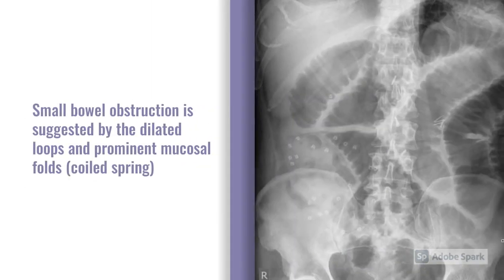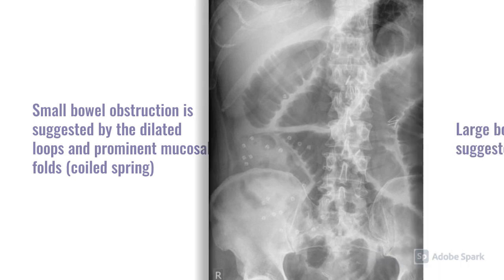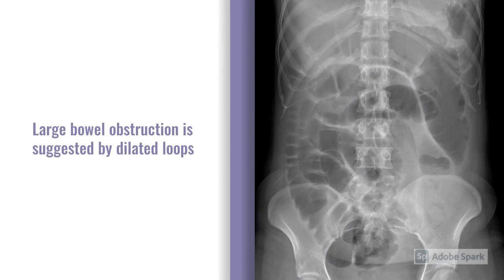The image shows an example of a small bowel obstruction, suggested by the dilated loops and the prominent mucosal folds, often described as a coiled spring type appearance. Even though those loops are dilated, they're not as wide as the large bowel loops — that's how we can say it's a small bowel obstruction. In the next example, we see a large bowel obstruction, again suggested by dilated loops — and we know it's large bowel because of its location and because of the size.